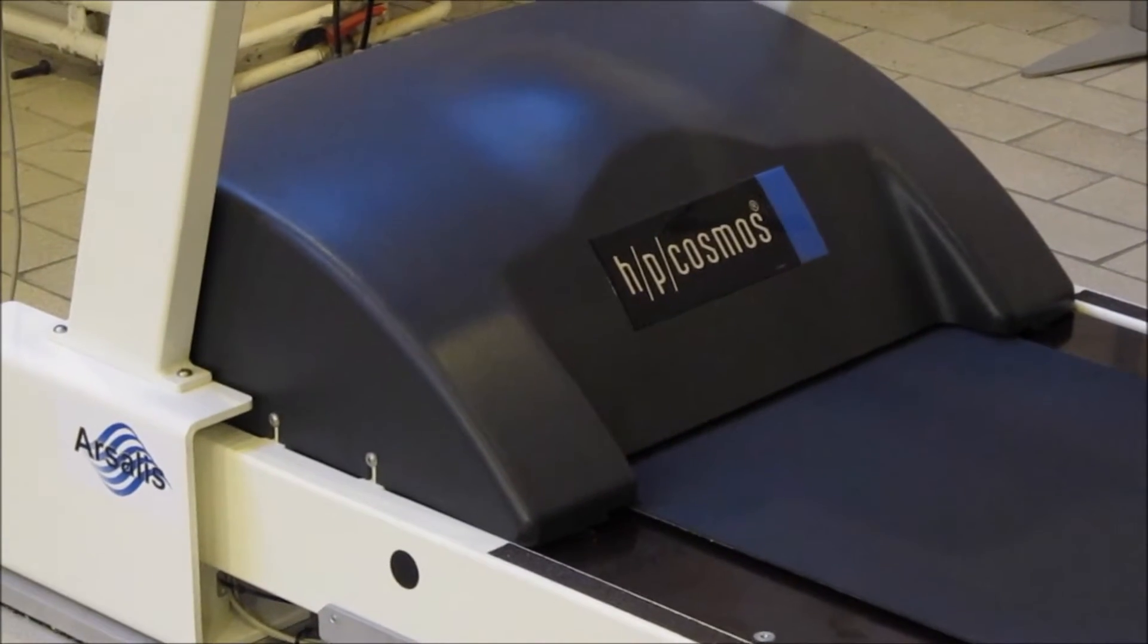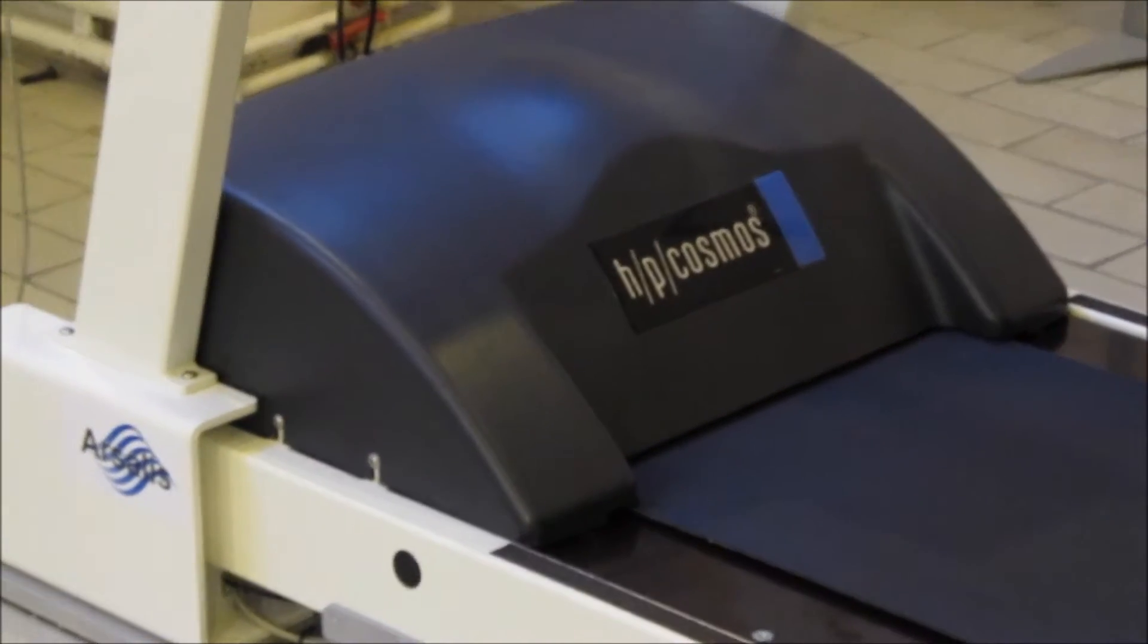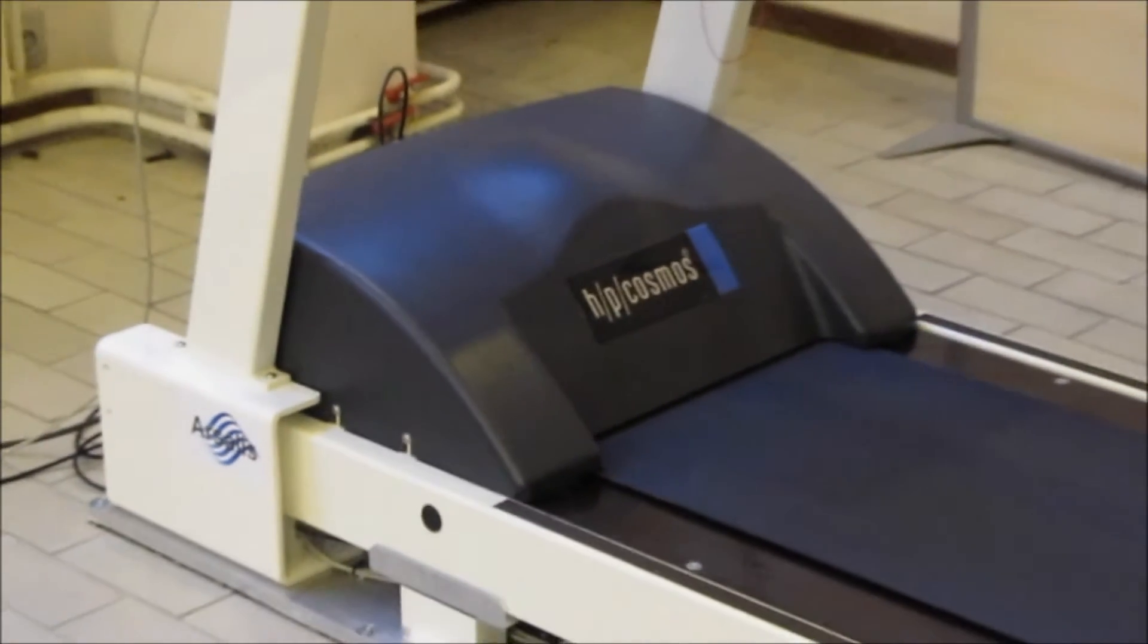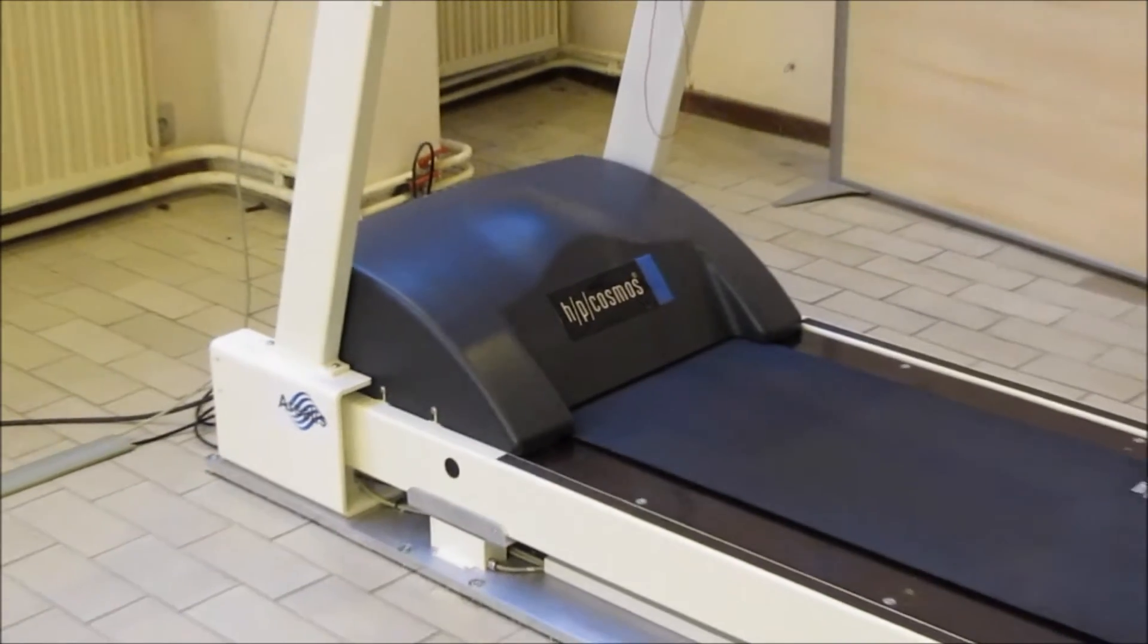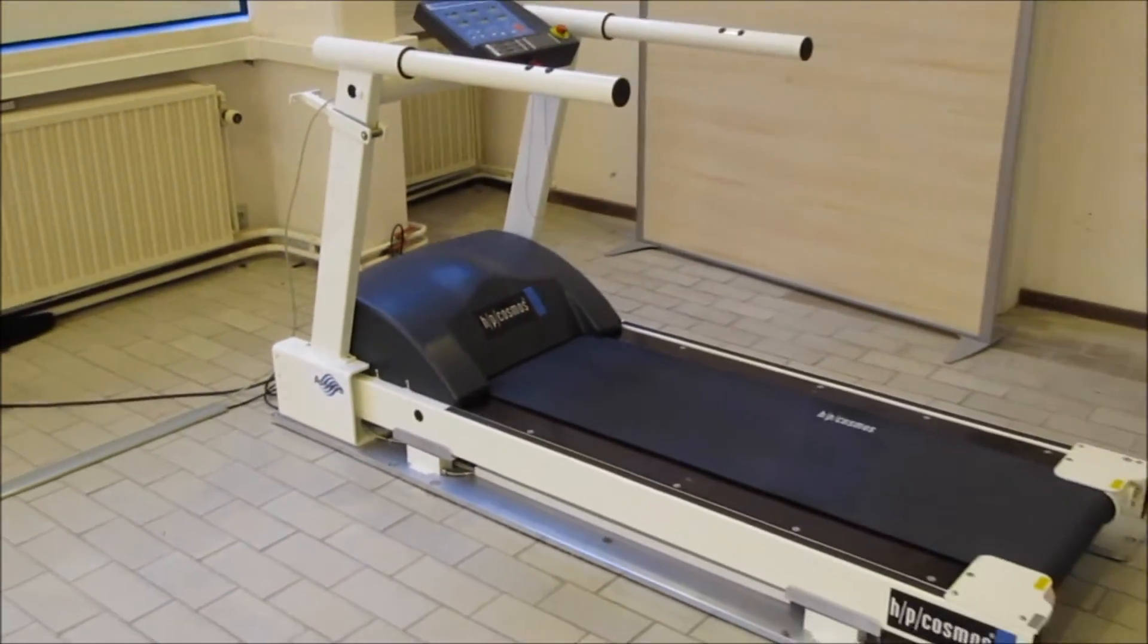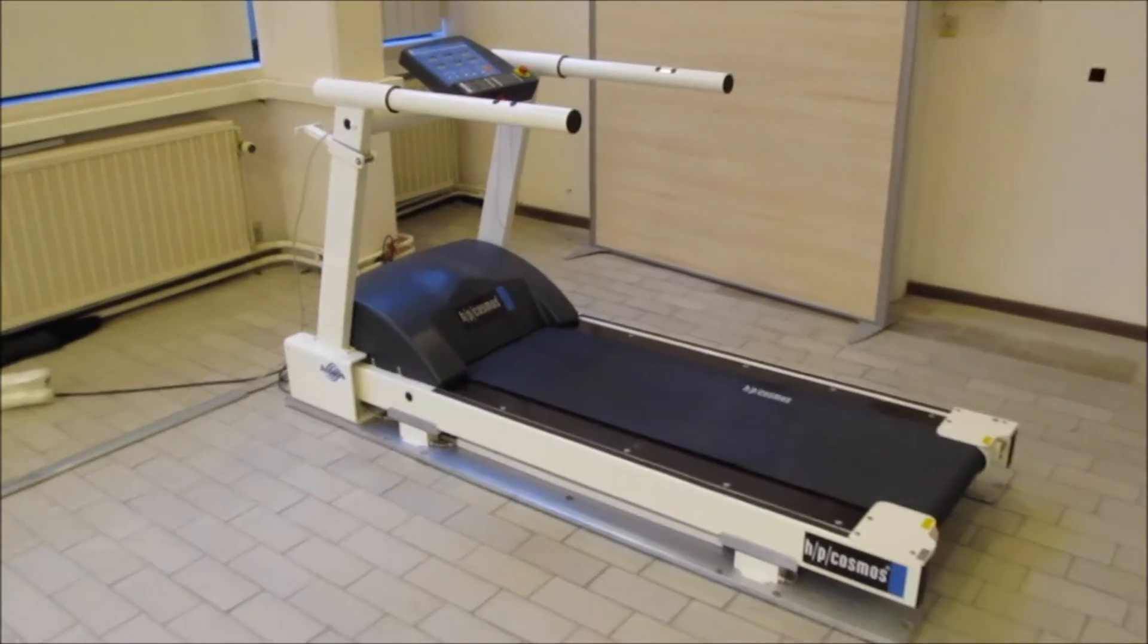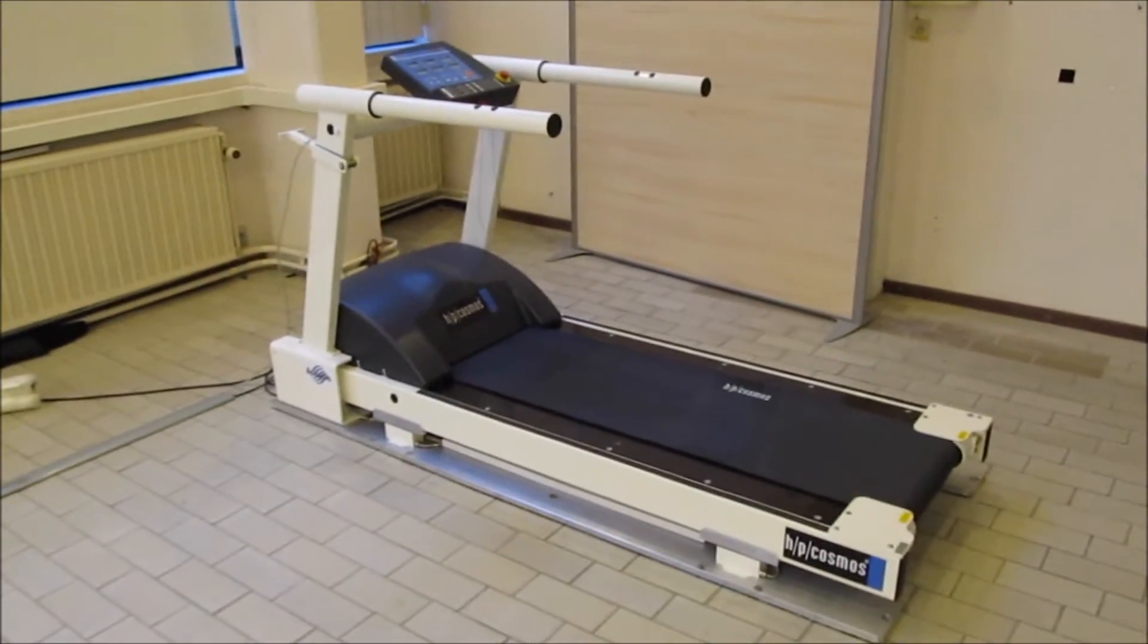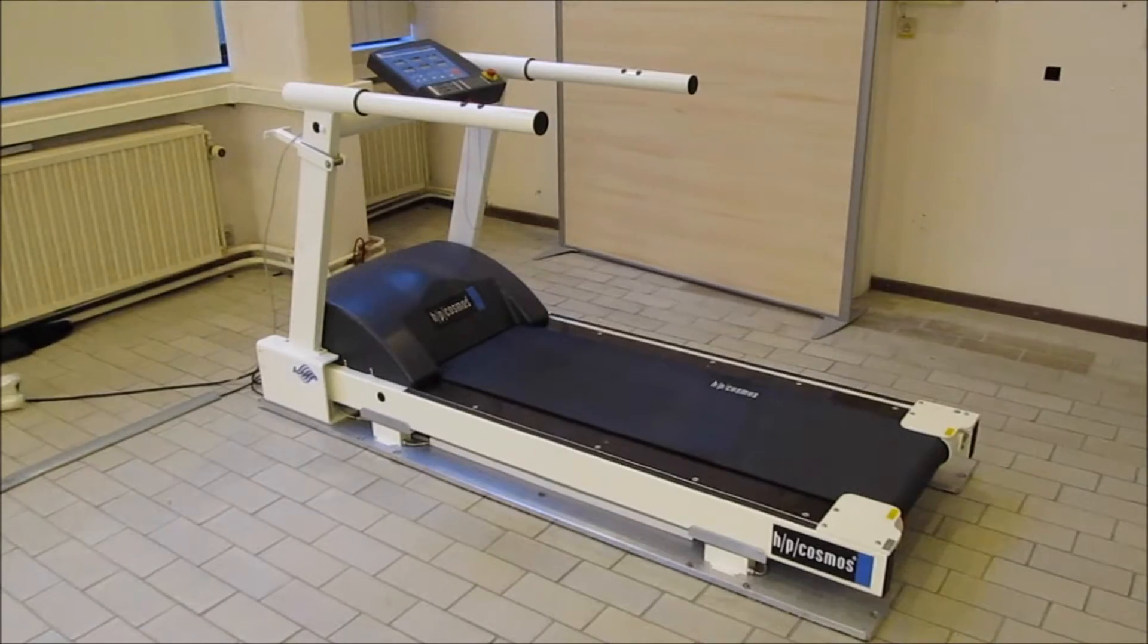The Gaitway 3D is an instrumented treadmill designed by HP Cosmos and Arsalis. The system shown here is optimized for walking and slow speeds of running.